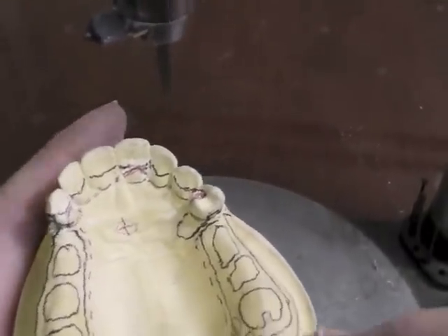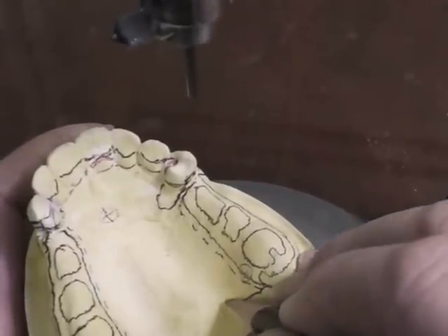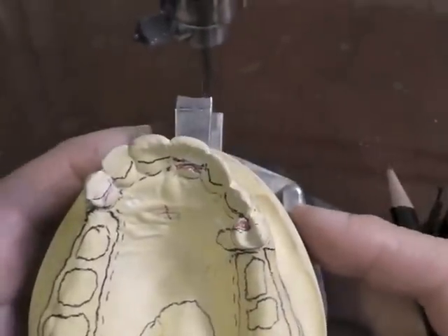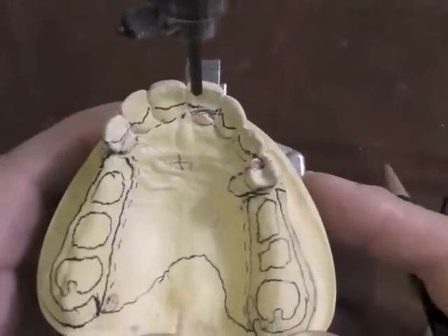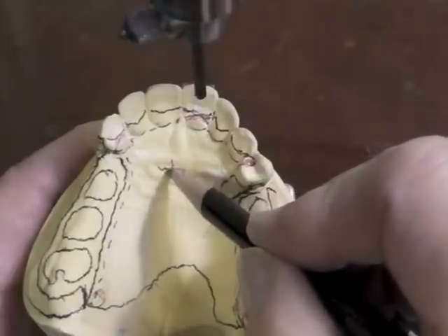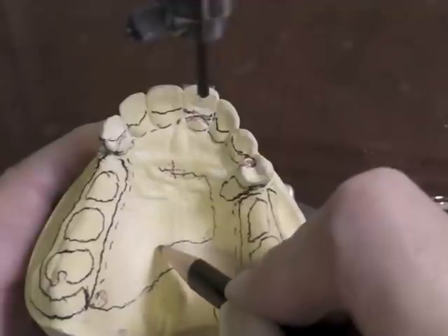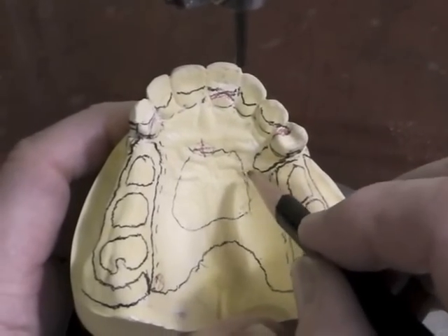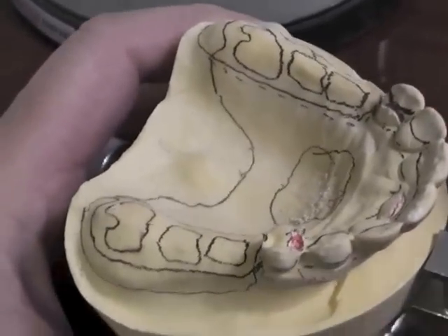Our major connector then comes around the torus and comes back over here. I could put a hole in it, coming up in here and coming back. I need to leave at least eight millimeters for my major connector back here, at least five millimeters in this area, four or five in that area.